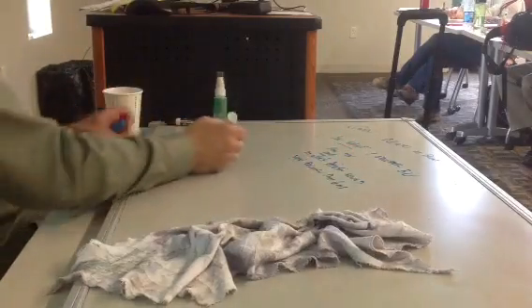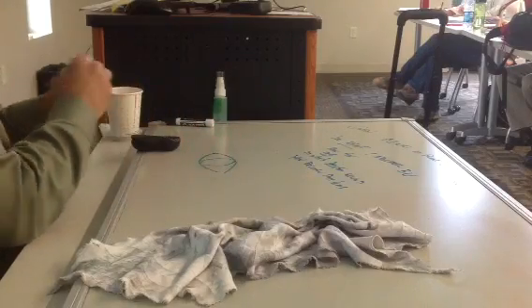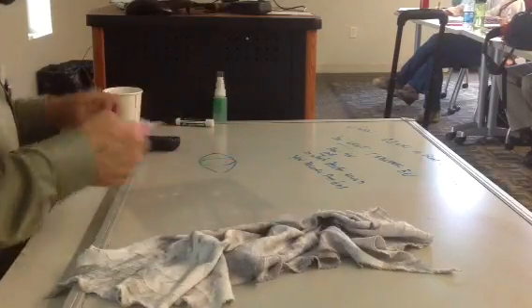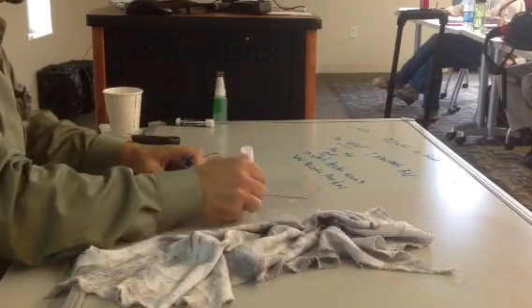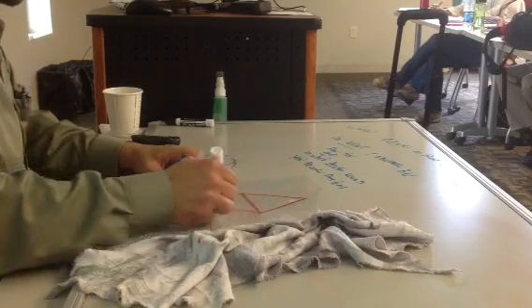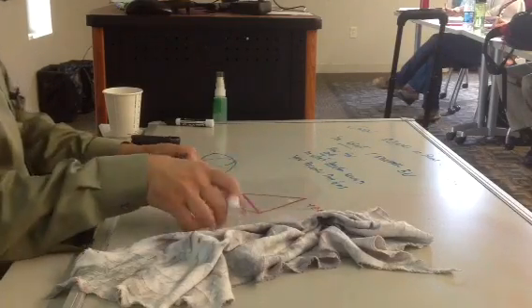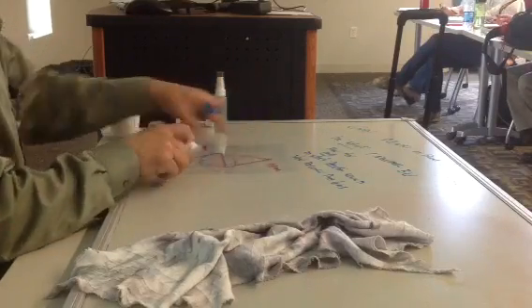So here we're going to have our little dude with blue eyes, my son, and we're going to break out our handy dandy lens, and let's say +2. If we're talking about side to side, I would do it this way. I'm doing it up and down, I would do this way.